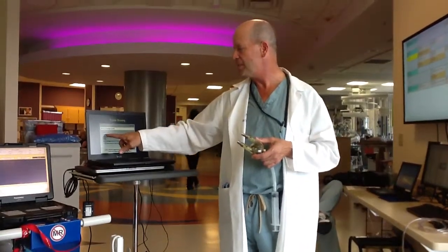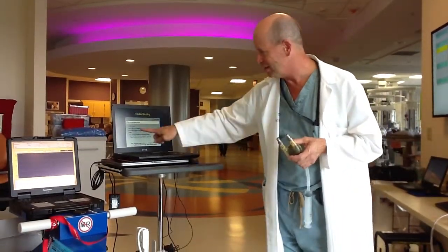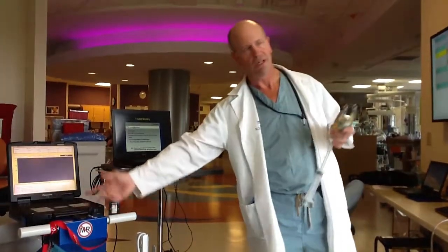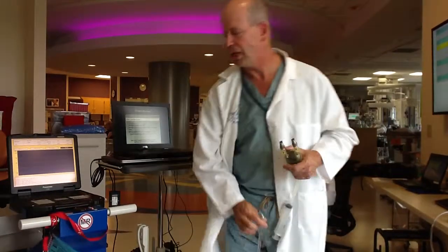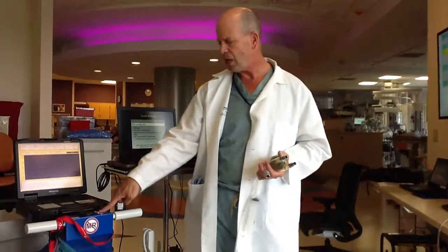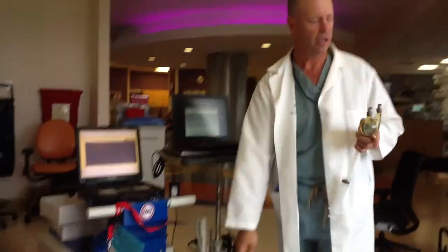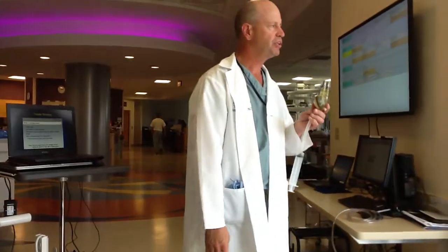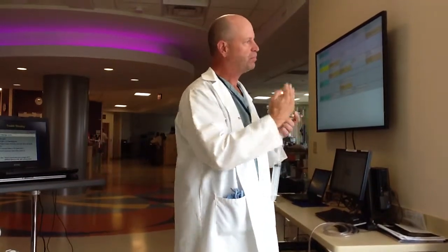Troubleshooting an error message: when you get an audible alarm, a light lights up and you hear a noise. Your initial reaction should be: how is the patient? Is the pump still filling and emptying? If it is, then that alarm is probably not a big issue. But if it's not, we've got to take action.